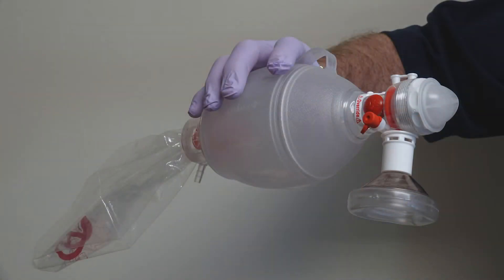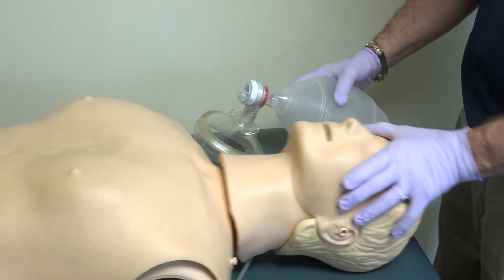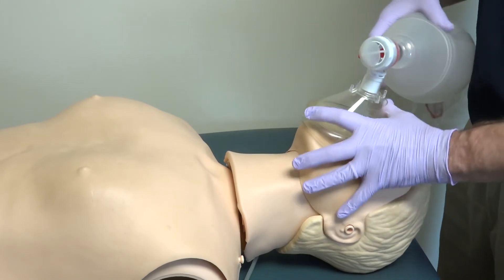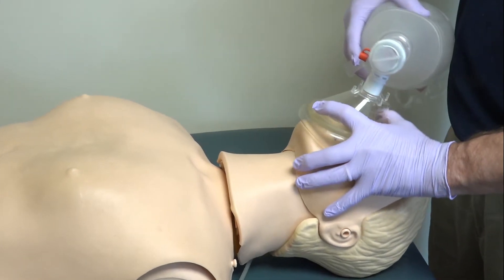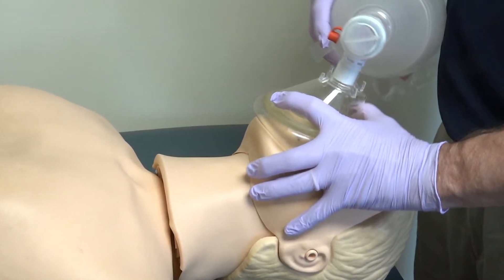When completing ventilations, you will be using a bag valve mask like this one. You will want to pull the mannequin's head back, clamp his jaw, and fit the mask over his mouth and nose, all while making a C-E shape with your hand.